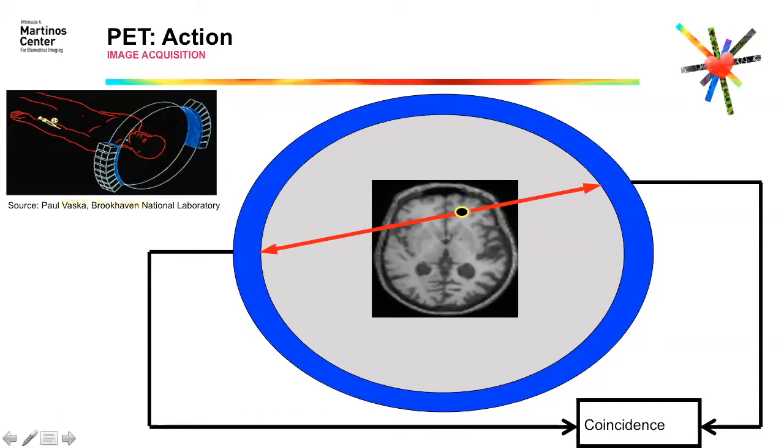wide scanner, basically. So there is some fast electronics behind those detectors, those camera detectors, that are telling us if one detector is hit at the same time as another one. And then we will know that there is what is called a coincident event. We know that a positron was emitted, a positron was annihilating with an electron, and these two gamma rays happen almost simultaneously. And this is called a coincident event. So this is only from one positron emission.